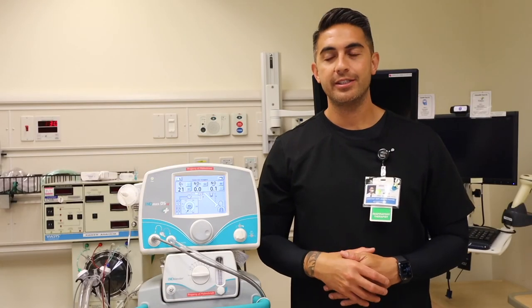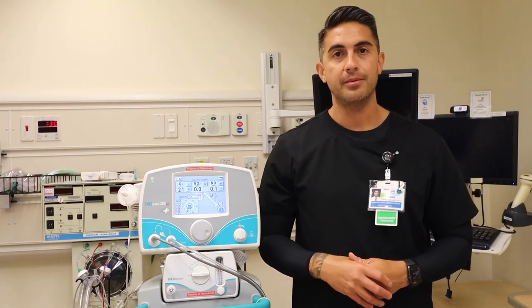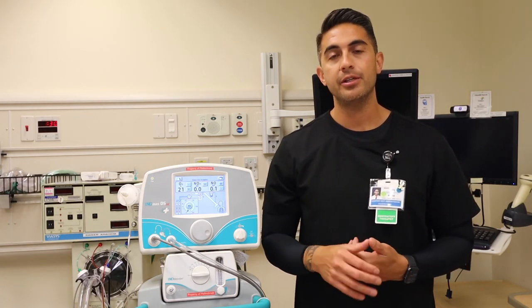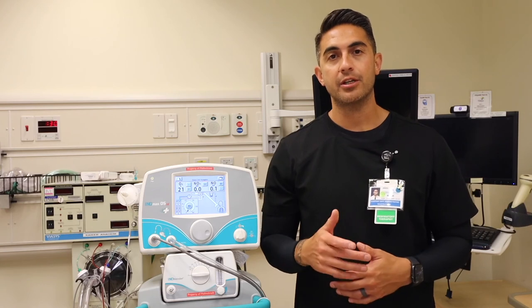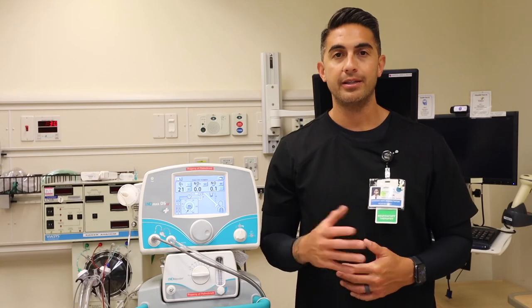Thank you for joining us. Today we reviewed the INOMAX DSIR Plus Nitric Delivery System. We reviewed the pre-use setup, a pre-use checkout, and how to place the injector module and sampling line in both the adult and neonatal ventilator circuit. Thank you.